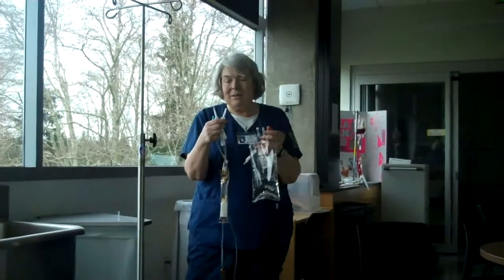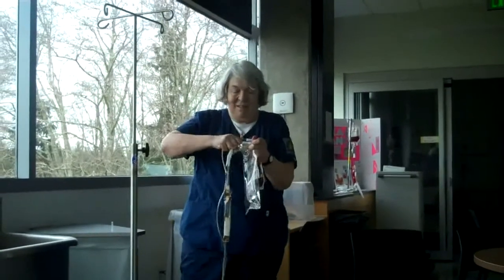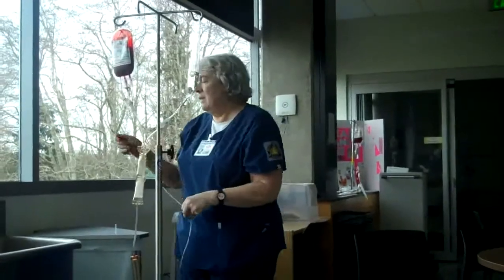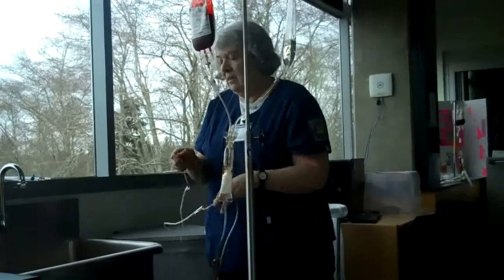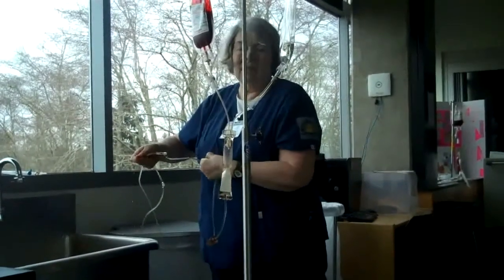At that point I will wash my hands, put on gloves, and prepare the saline and then the blood. Everything's been clamped so all the outlets are closed. I'm going to spike my saline and spike my blood or I could hang it. I've got both of these spiked. I'm going to prime my line, put the line into a trash can, open up the saline on both ends, open the line, and prime to go above the top of the filter, making sure I'm getting all outlets clear. I can then close the saline.